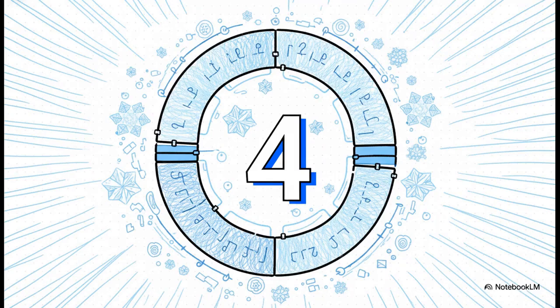To actually orchestrate this physics symphony, we have to zoom out to the macro level. This number right here, 4, it is absolutely critical. 4 Kelvin, which translates to negative 269 degrees Celsius. That is the temperature of the liquid helium used in the cryogen system to cool the main magnet.